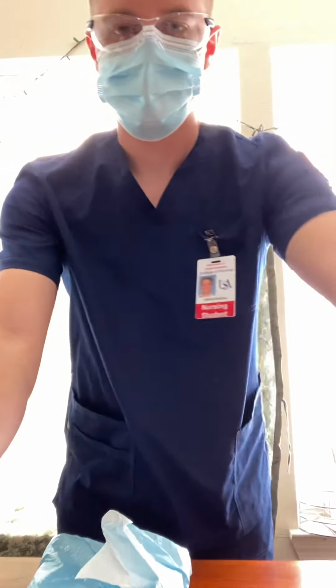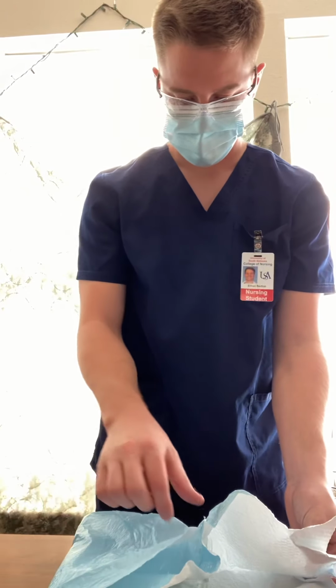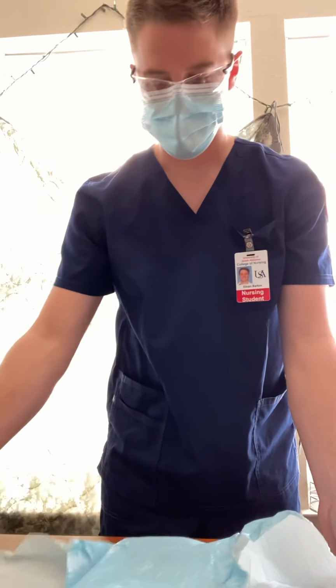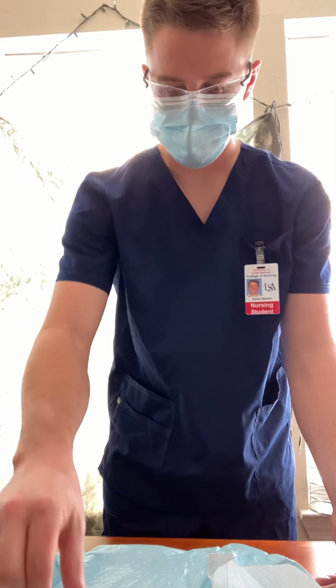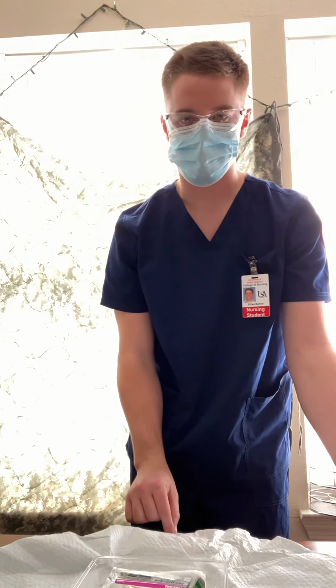And after I've done that, I'm going to perform hand hygiene. Next, I'm going to open the rest of my kit. Trying to get this so you can see. Noting the 1-inch border. Also, it should be at waist level or above, and anything off the table is considered unsterile now. So after I've done that, I'm going to don my sterile gloves.